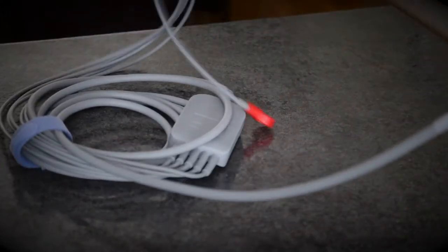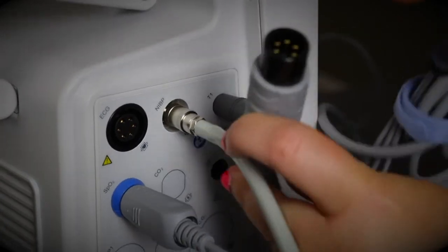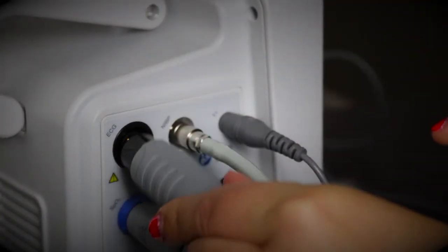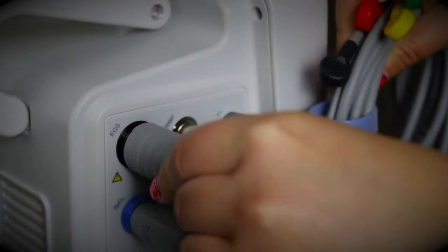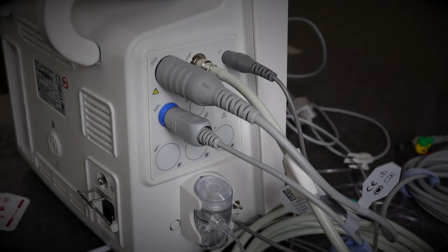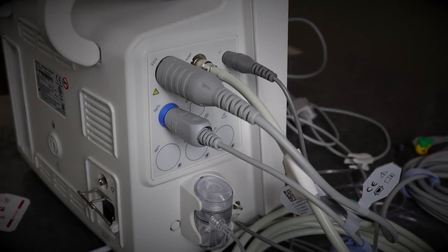Now I'm going to show you how to connect the ECG leads. There is a little slot that marries up with the machine. You pop it in there, give it a push, and you're ready to go.